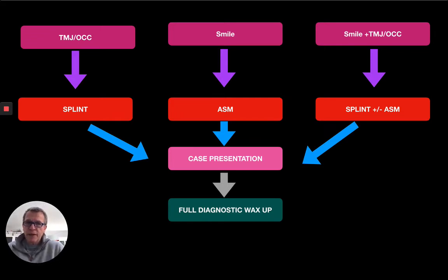You're thinking the patient might be interested, but the only way you can do this is a full diagnostic wax-up. And you're going to either spend hours doing it yourself, or lots of money with the technician, and you're not sure whether the patient would pay that right now because they haven't been motivated enough. They haven't been engaged.